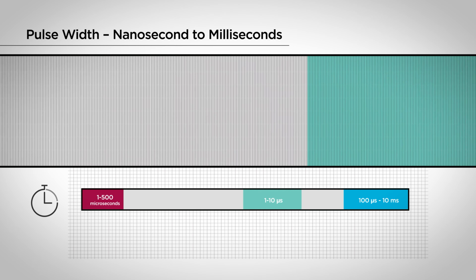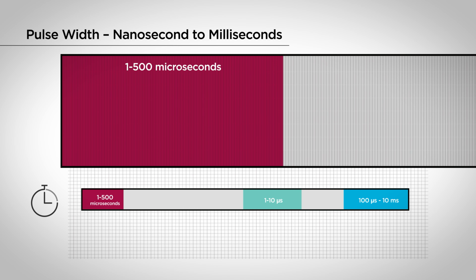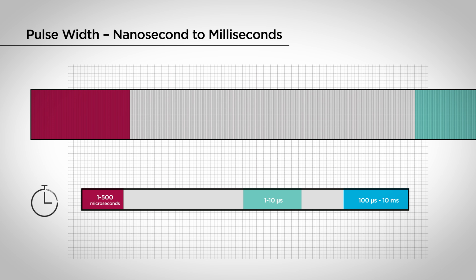Some systems are also utilizing so-called nanosecond PFA. However, many of these systems often deliver in the range of several hundred nanoseconds, which at the end of the day is really just 0.1 to 0.5 microseconds, and therefore is really not an order of magnitude different than microsecond delivery.